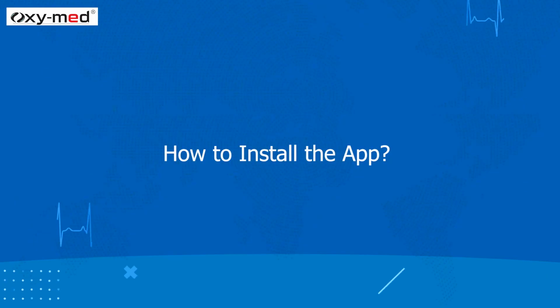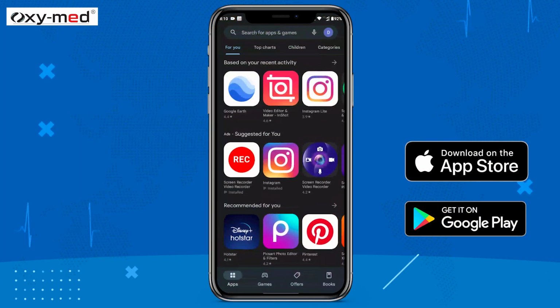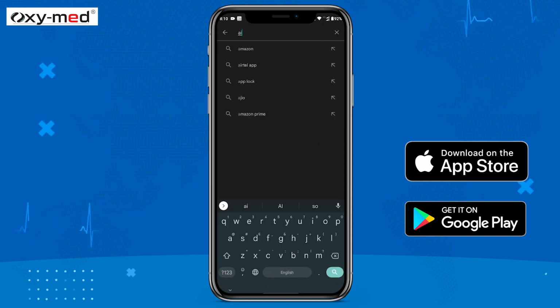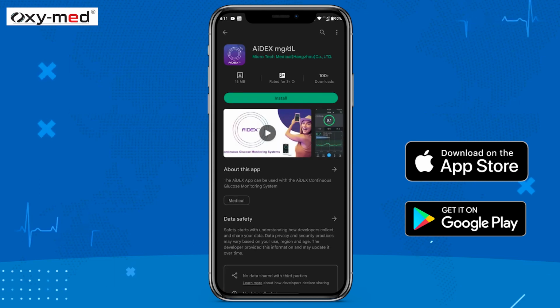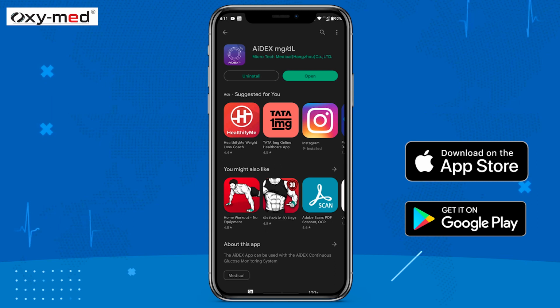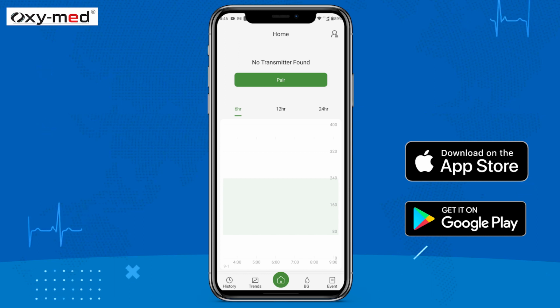Now let us see how to install the app. Download the Aidex app from Play Store or Apple App Store. Once the installation is done, open the app and create an account, or log in if you have an existing Aidex account.